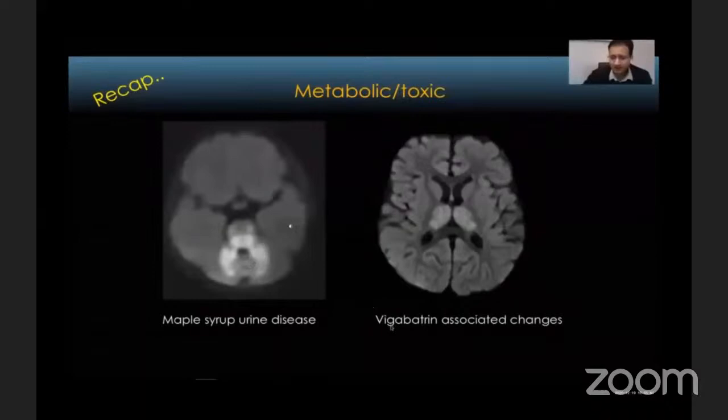Then we saw vigabatrin associated changes. This is something which is fairly common in kids who are being treated with vigabatrin for seizures, and these kids are typically not very symptomatic, and the condition is reversible, sometimes even with continuation of vigabatrin.